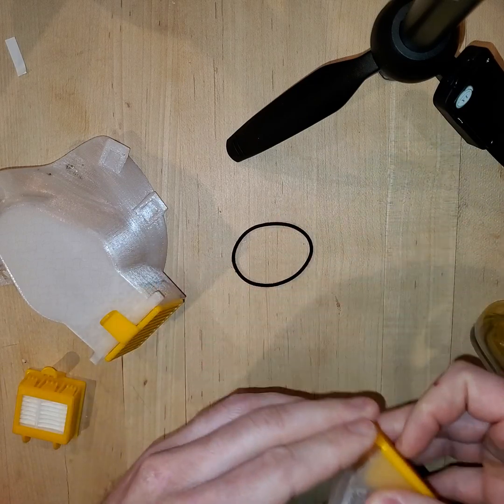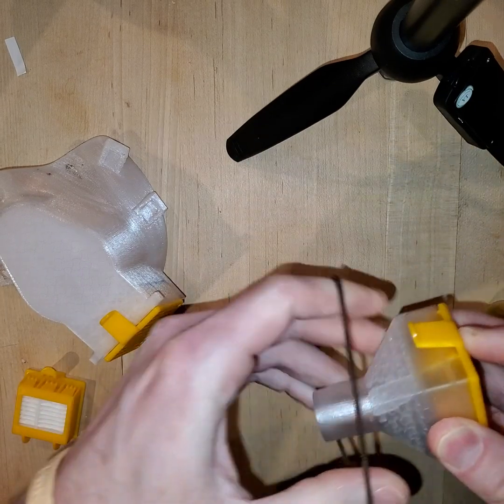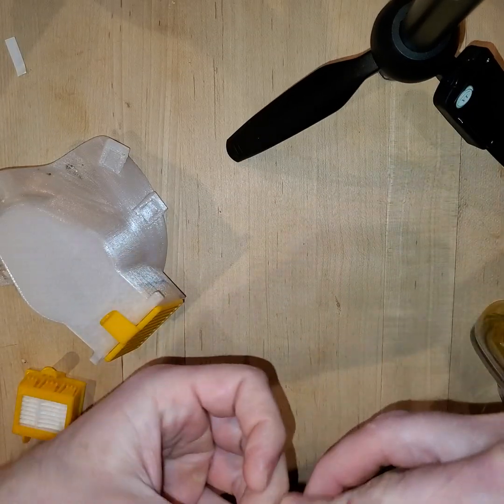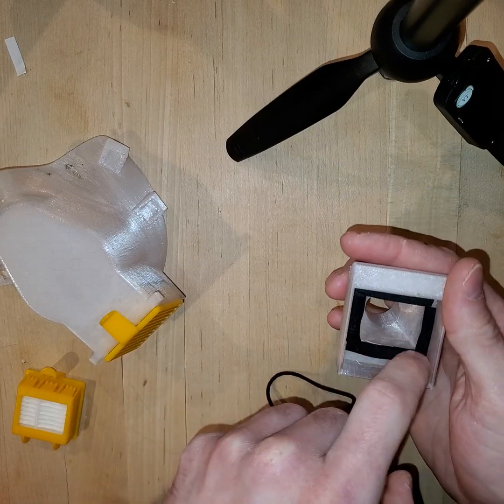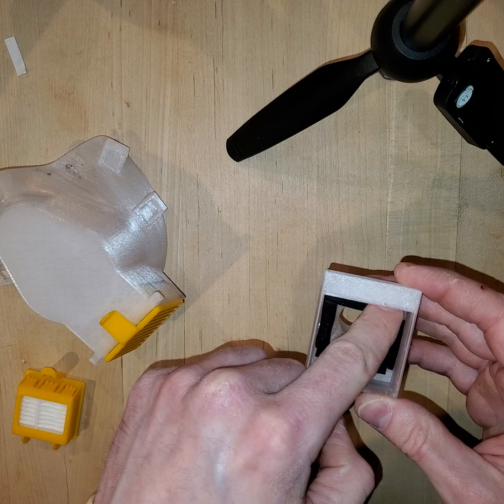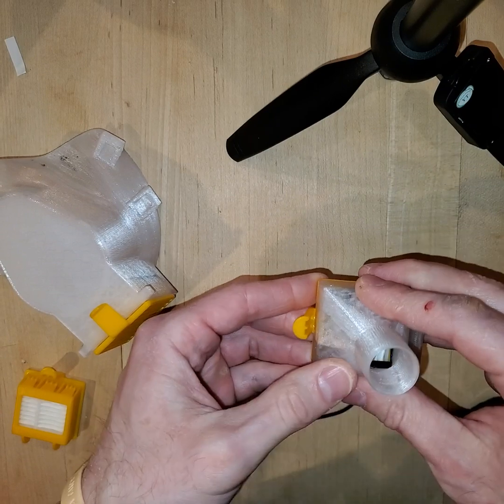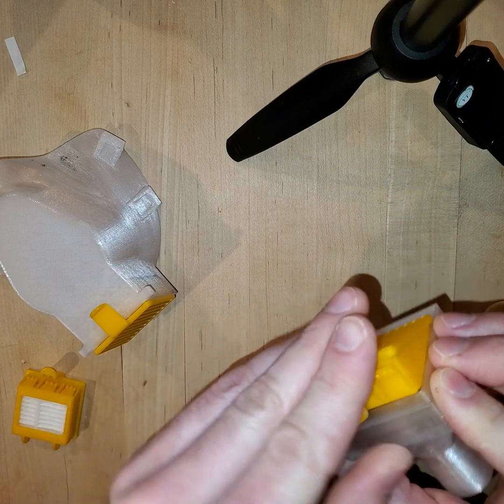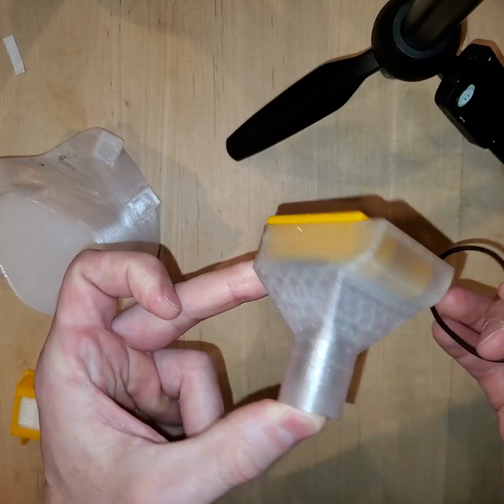Now, I've added a couple little things to this. First of all, if you want, you can take an elastic rubber band, or in this case, a hair tie, and lock this down so that it just fully stays seated. I've also added on the inside a 1/16 inch foam tape to create a gasket of sorts, a membrane to really create a good seal between the filter itself and the adapter. You see that the hole is only the size of that, so nothing gets past it. So again, it's pretty secure as is, but to hold it down that extra little bit, the hair tie rubber band helps.